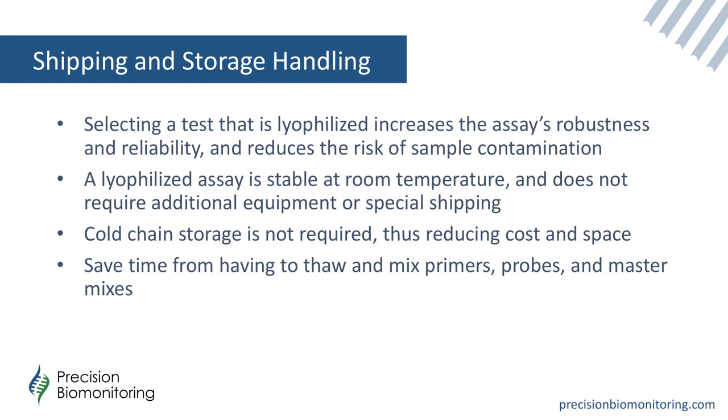So for shipping and storage handling, there are different options. Certainly, lyophilized or freeze-dried assays increase the robustness and reliability, and if they're packaged as individual tests, that also reduces the risk of contamination, compared to going from bulk reagents. These assays are typically stable at room temperature. You're not looking at thawing or additional equipment for storage and cold chain requirements, so cost and space requirements can be reduced.